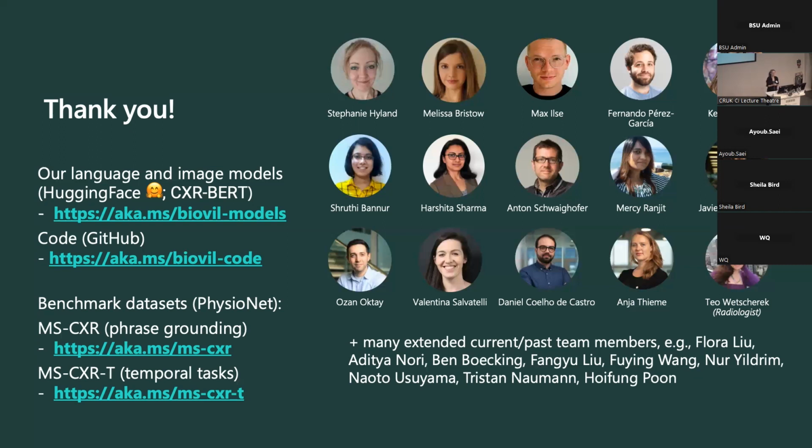Second question, to do with not using attention for the current image. So we are. I probably didn't explain it very clearly at the time. Basically, we have a pass-through for the current image, so we always preserve the current image features because the report is corresponding to the current image. The attention is over the current and the prior images. So we actually concatenate them, and then we do self-attention across all of it. We did experiment with not doing the pass-through initially because we thought we'd just ask the transformer to combine all the information. But we found that because the current image is so important, adding that pass-through is quite helpful.